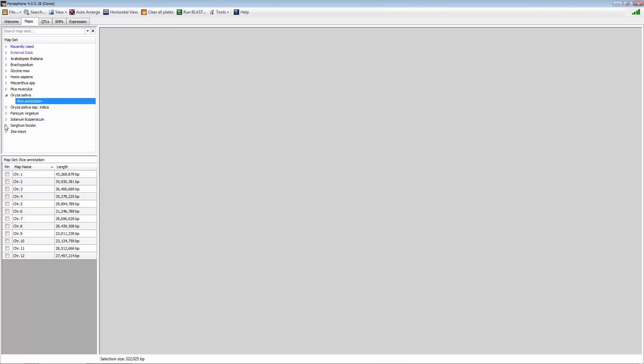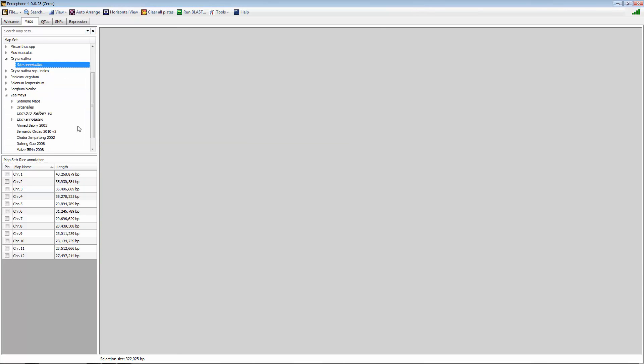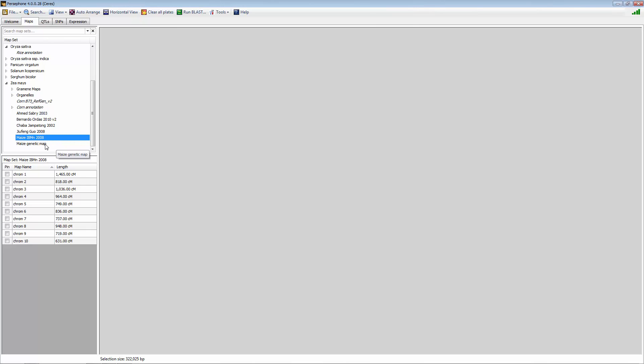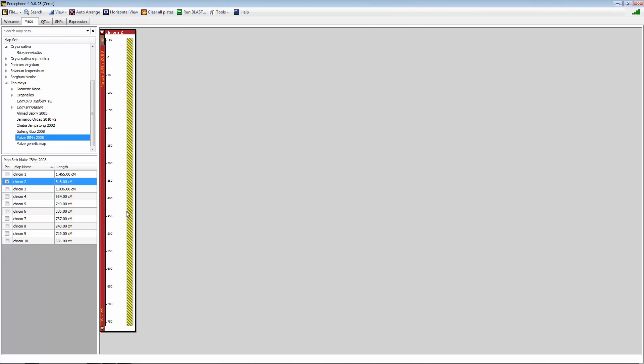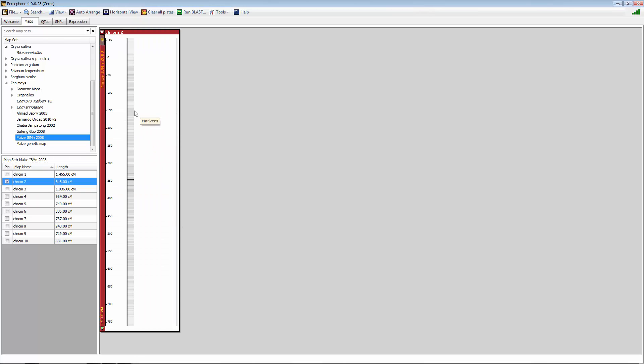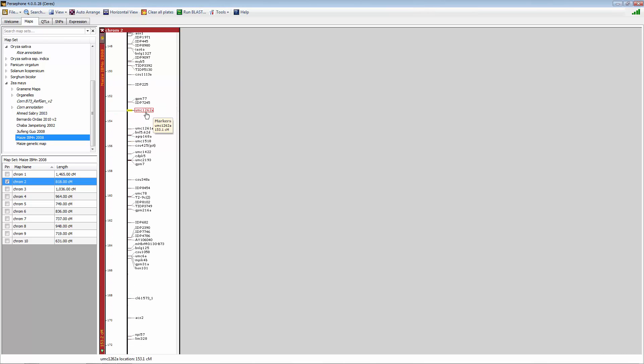You can also export off of a genetic map. So for example, we have this Maze IBM 2008 map. If we brought up chromosome 2, once again, you can zoom into this map very easily and see all the different markers.